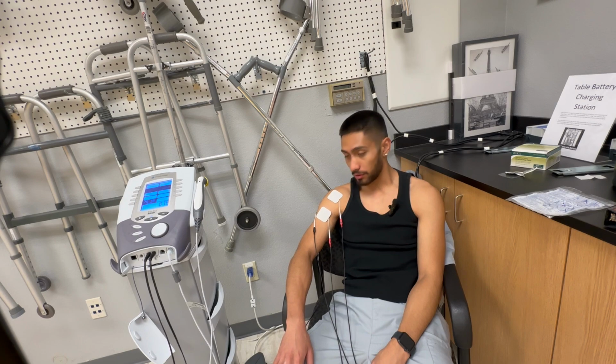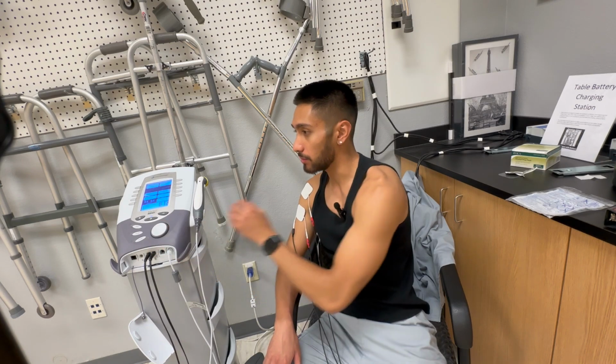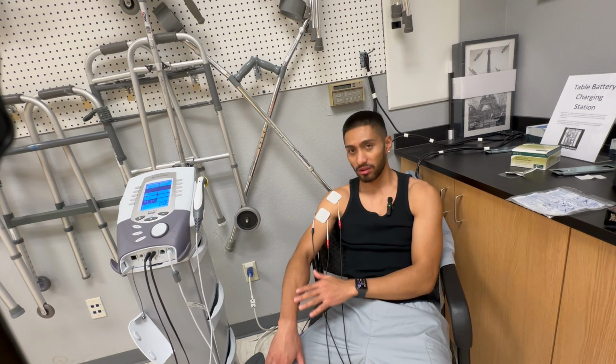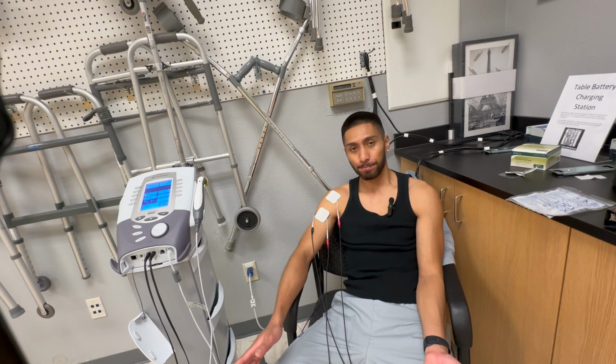There's a tingling sensation going on. There's some muscle twitch going on, so we want to turn that down. It's not too much. You feel a slight little twitch going on, or just a light rub on the skin. So that's how I can describe my tingling sensation. Again, it varies patient by patient.